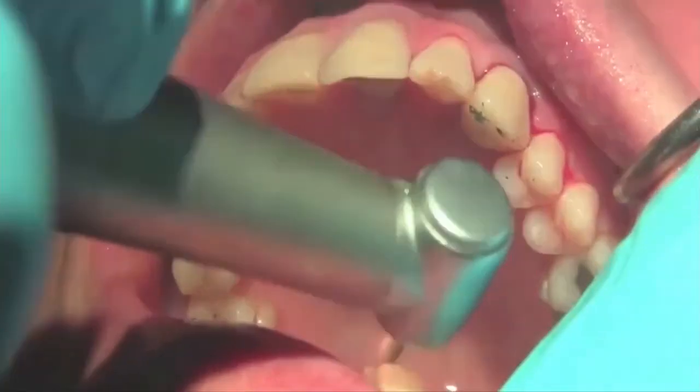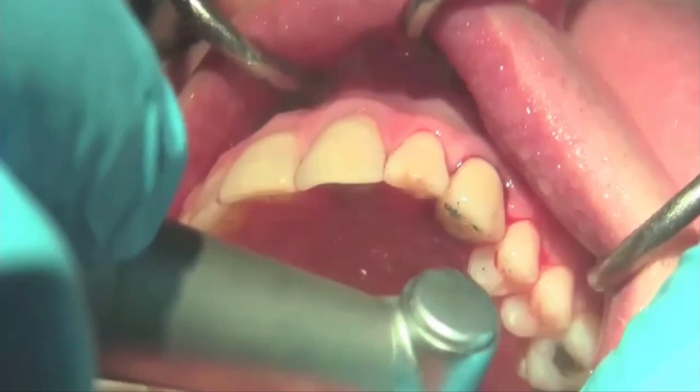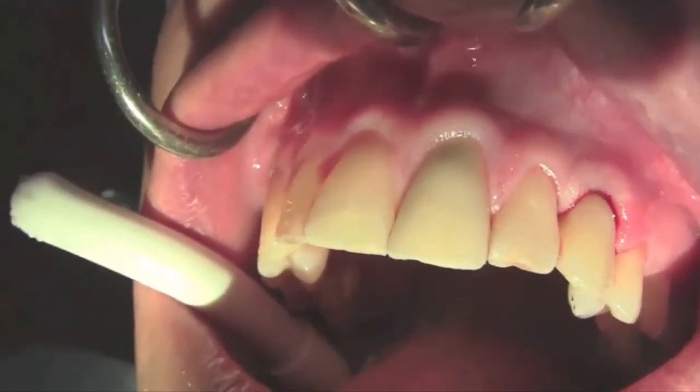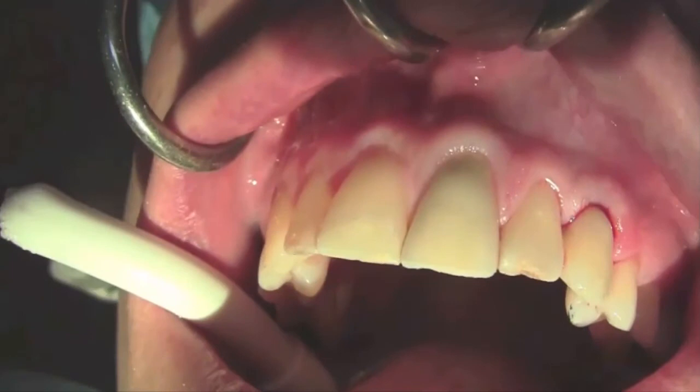There are no changes whatsoever, and what we're doing at this point is trying to smooth the incisal edges of the adjacent teeth, and we're also checking the occlusion, trying to get the best occlusal setup possible. We want to have contact in closure, but we don't want contacts in eccentric. One of the things that we do before the surgery is play with the lateralities, trying to reorganize occlusion, going more into a premolar function, and trying to avoid canine contacts in lateralities and anterior-posterior movements.